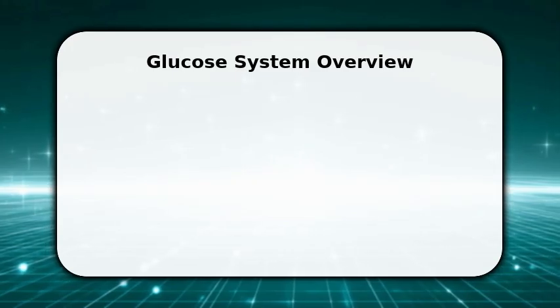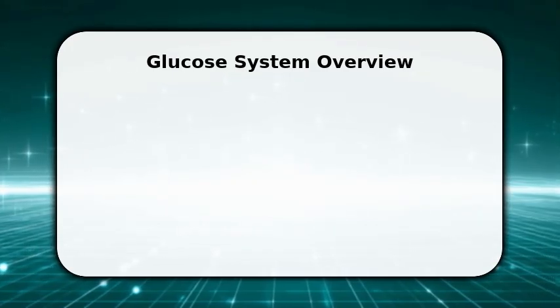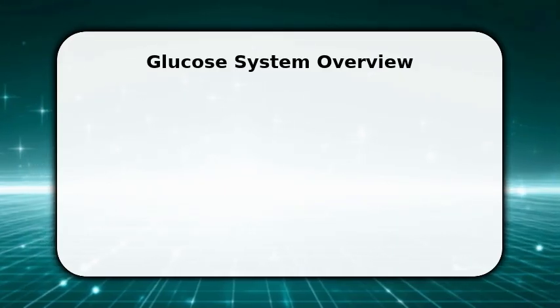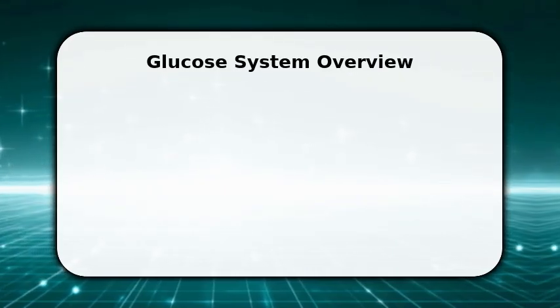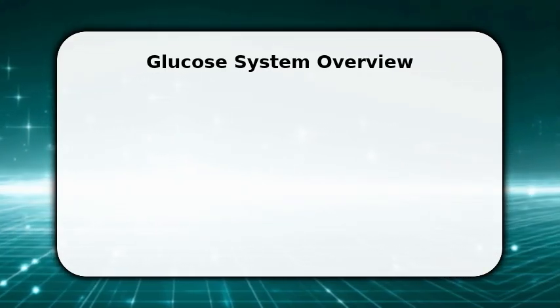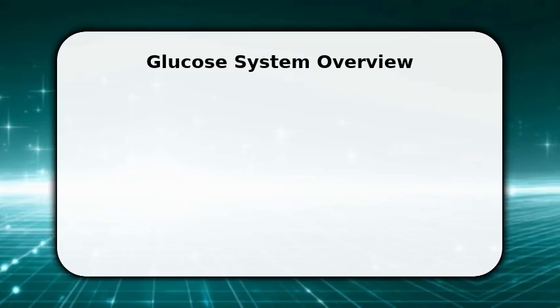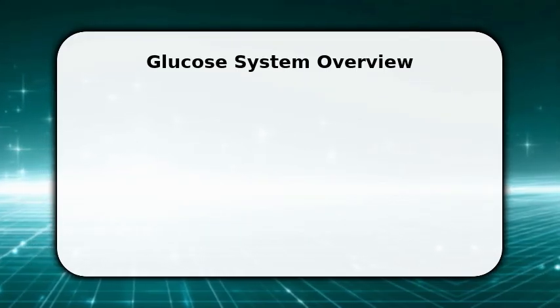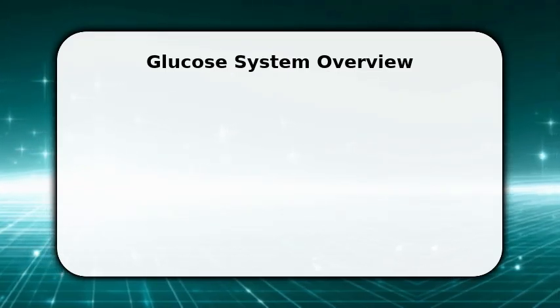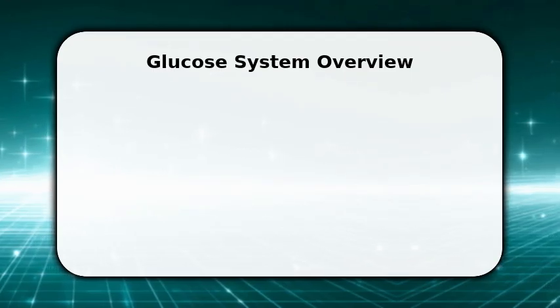Enjoy the video. This overview explains how a continuous glucose monitoring system functions for everyday users. A continuous glucose monitor measures interstitial glucose every 5 minutes for trends. Data processing converts raw sensor current into mg per dL values. Aim for clinical accuracy within plus or minus 15% across the 40 to 400 mg per dL range.